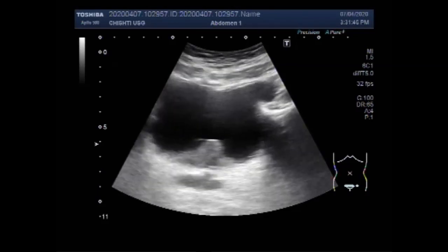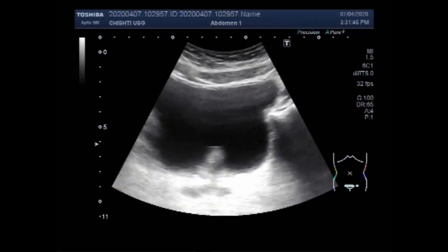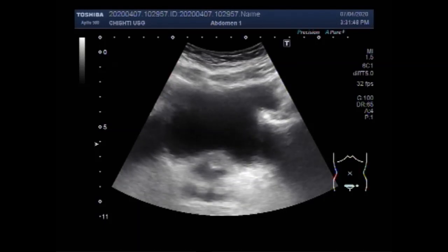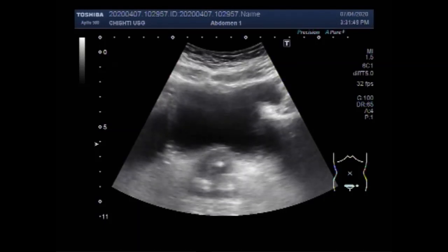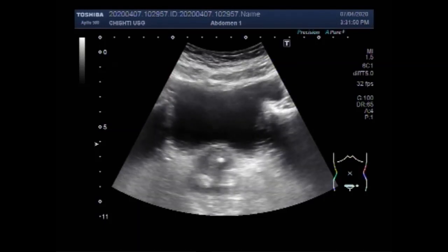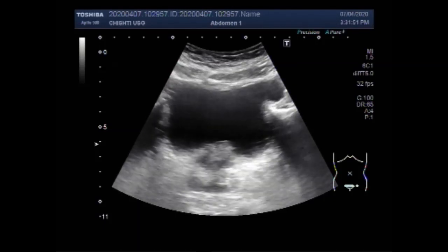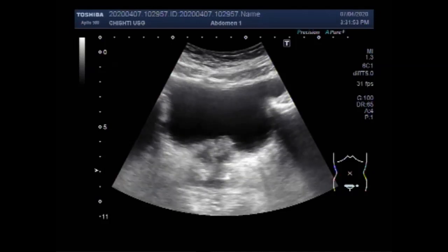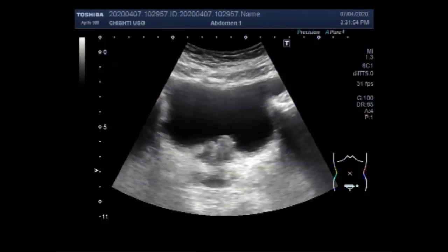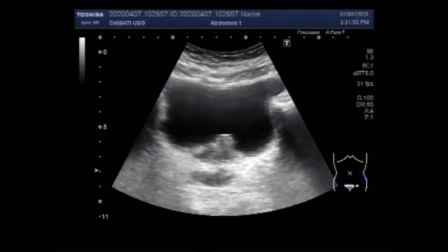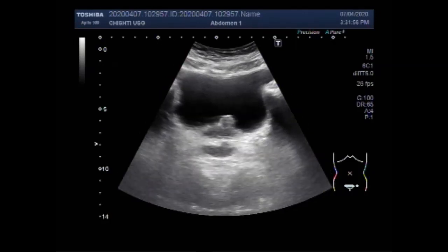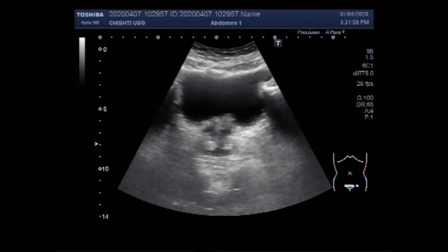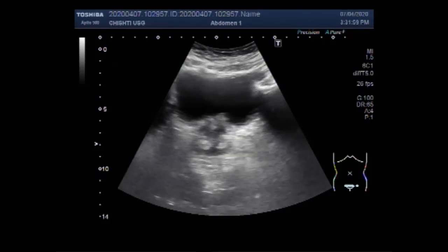Bladder ultrasound is a safe and painless test that uses sound waves to make images of the bladder before and after urination. During the examination, the ultrasound machine sends sound waves into the bladder area and images are recorded on a computer.